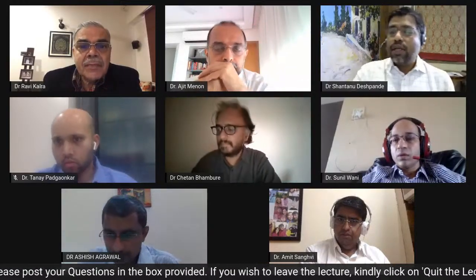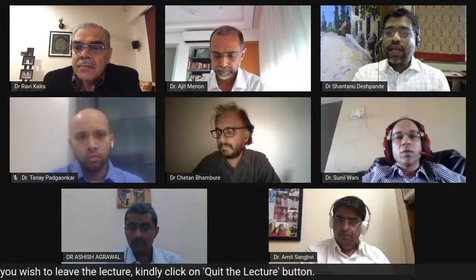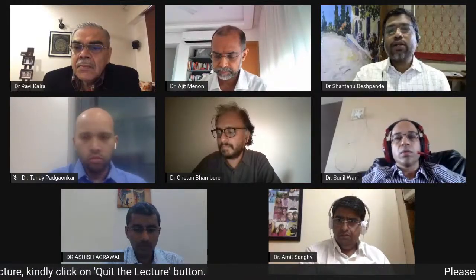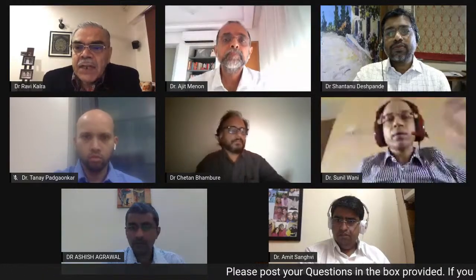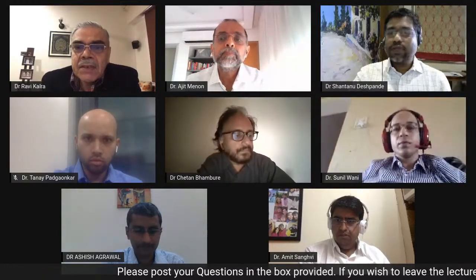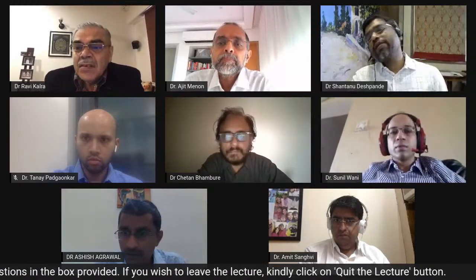Well done. So basically, can Corsair or Caravel be used in calcified lesions? For that matter, Tornus even. And that's a comment from Dr. Kirti Punamia: Don't ever use a Corsair in calcified lesions. Caravel should be cautioned on torquing.